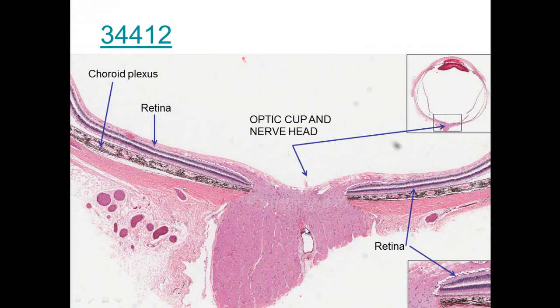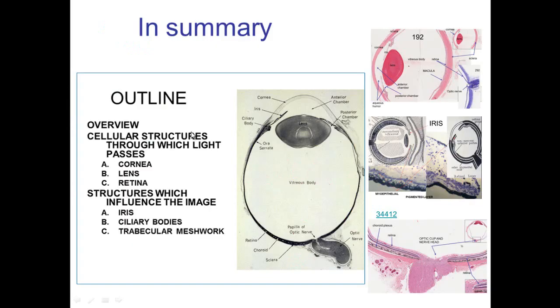The blood vessels are coming in through there, making a plexus, and the optic head here is where you don't have photoreceptor cells, and indeed that would induce your blind spot. Choroid, very nice choroid here, blood vessels in the retina, which is very nice to see.